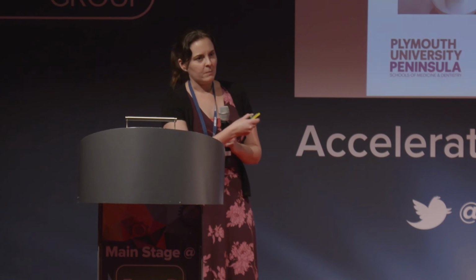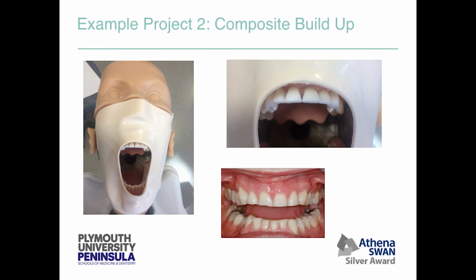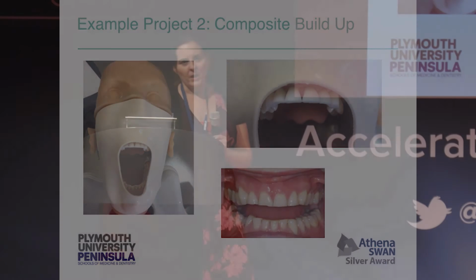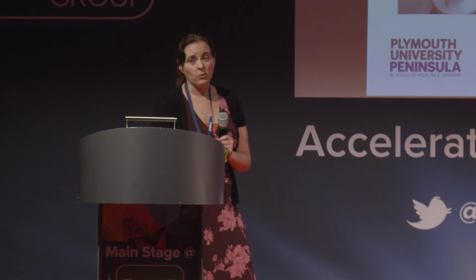So this was actually done on a Form printer. We're at the other end of the spectrum now, from the most expensive printer to one that's quite affordable. And we printed out these teeth. We took the front six teeth and we modeled them so they were already worn and printed those teeth out to fit in the phantom head. And this saves a lot of time and also saves waste from throwing away teeth or just buying new teeth and drilling them.